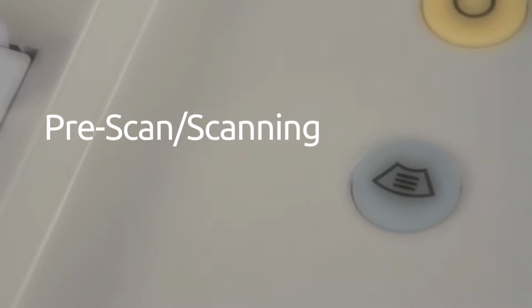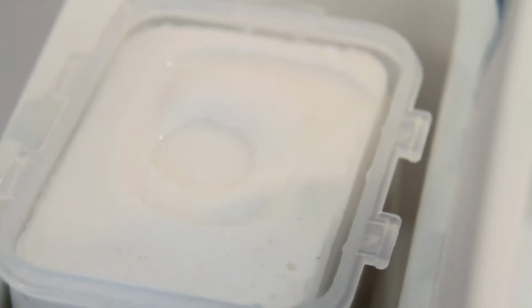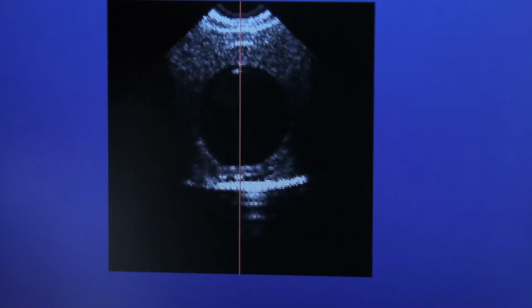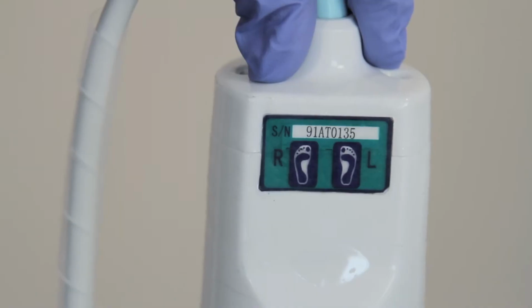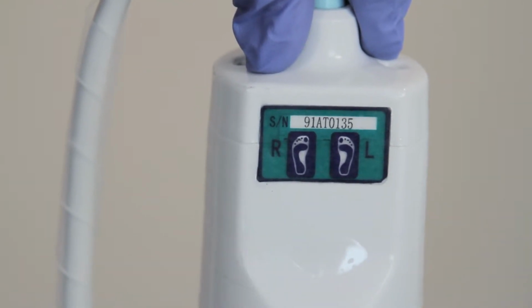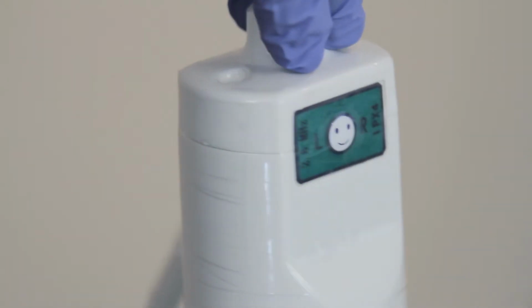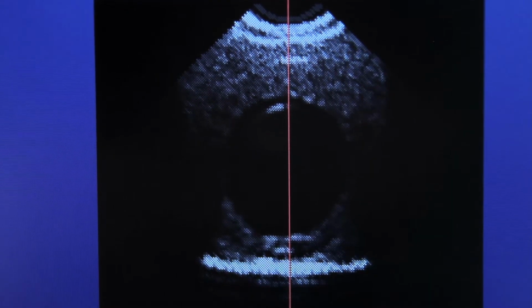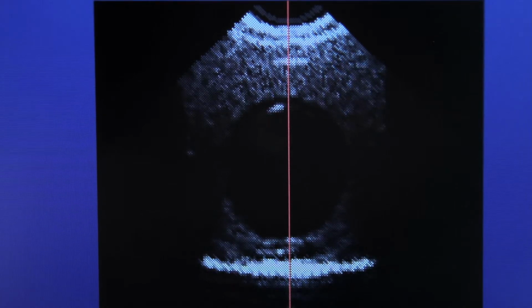Press the Scan key on the control panel to enter the pre-scan screen. Place the probe on the phantom bladder to see a real-time image on the pre-scan screen. Make sure when working on a patient, the probe is correctly placed and the feet on the probe are oriented towards the patient's feet and the face is oriented to the patient's head. The straight red line indicates the center of the area being scanned.